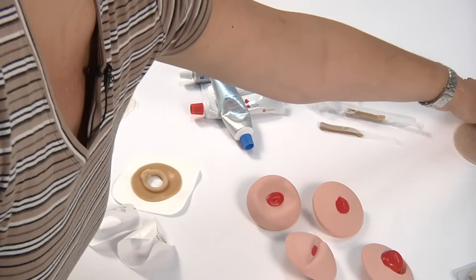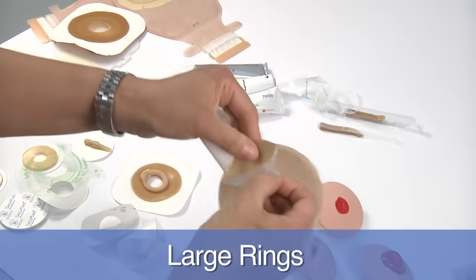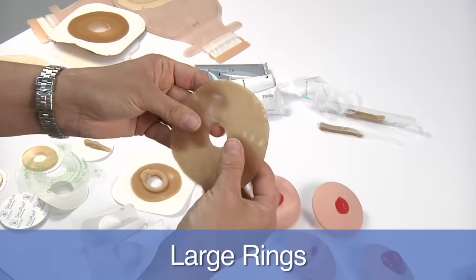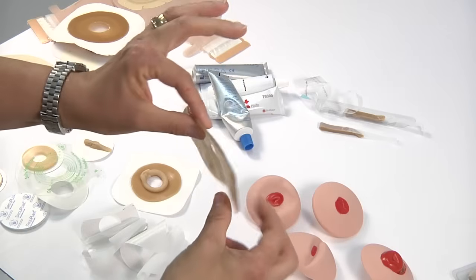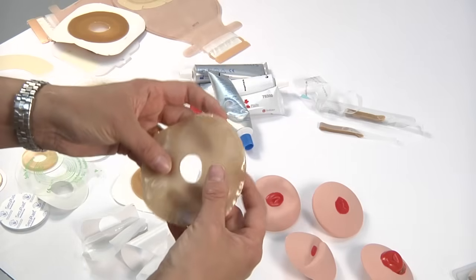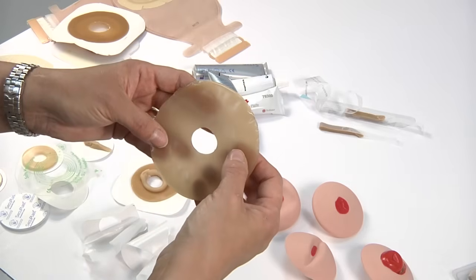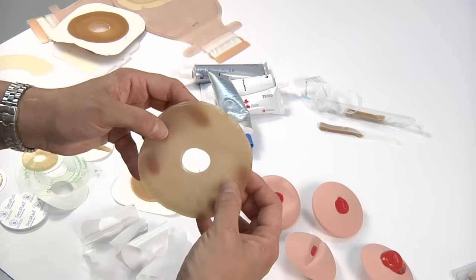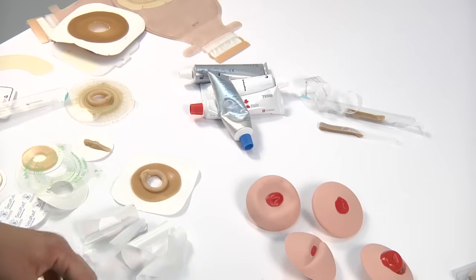Barrier rings also come in larger sizes like this, okay? And again, it's the same idea, it's just a larger version of the smaller ones that we saw earlier, and you would want to stretch that out into the shape. They're fairly thin. They're probably closer to a slim version of the smaller rings than they are the thicker ones. But if you have a large area of open skin on the surrounding area, or some people use this as an interface between their pouching system and their skin, this is an option as well.